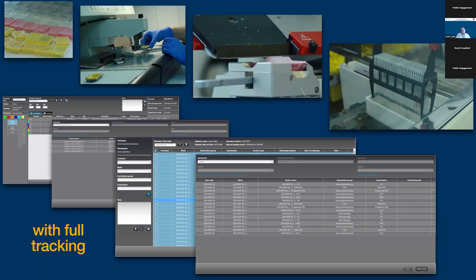The only way to know it, especially once you hit the big magic number, which in my experience is about 25,000 specimens per year, is tracking. Otherwise, even with the best human-controlled ledger systems, you will lose track of what is going where. It's important to be able to identify the different elements of your workflow with light speed and make sure that you get them as and when you need them.